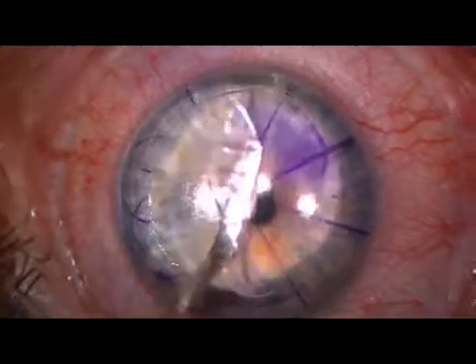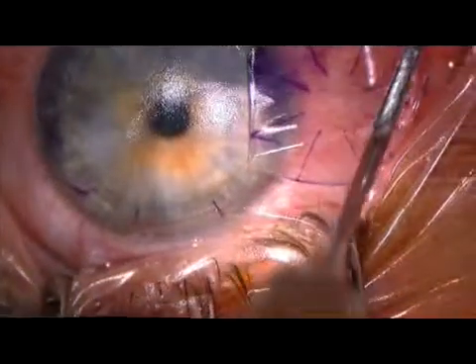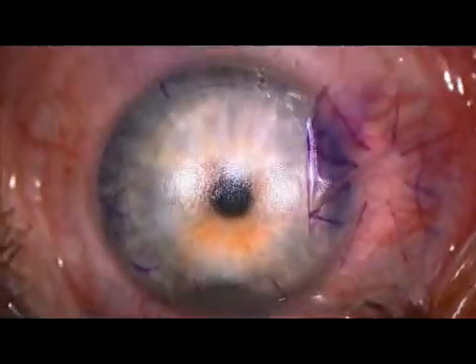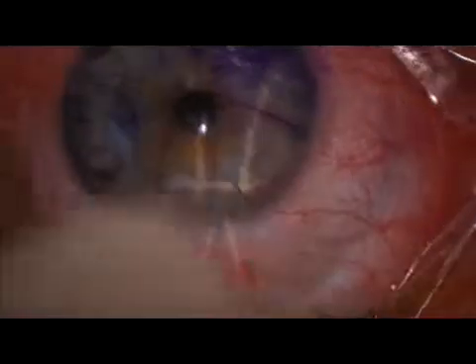Again, the flap is atraumatically lifted and the nearly perfect stromal surface is exposed. No drying is necessary. The laser is applied and the flap put back into position.